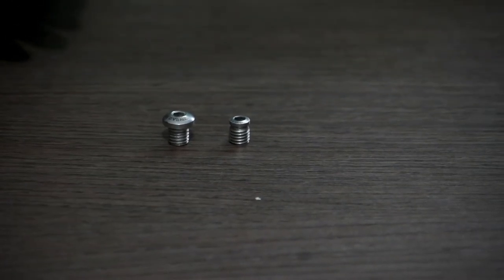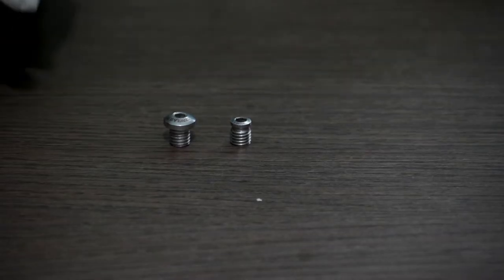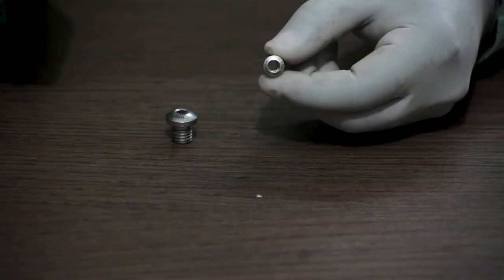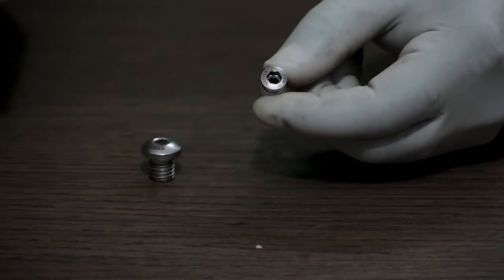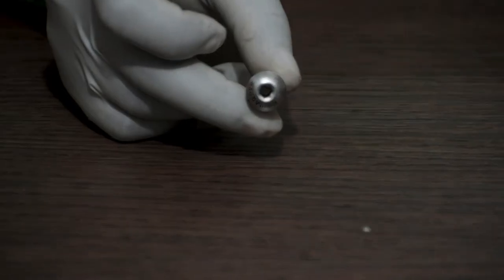It's fixed on the head of the nail. Available in the size of 0 mm, 5 mm and 10 mm. This one is a 0 mm. And this one is 5 mm end cap.